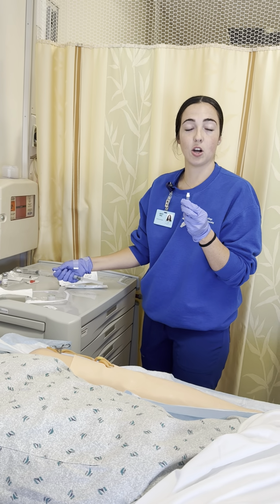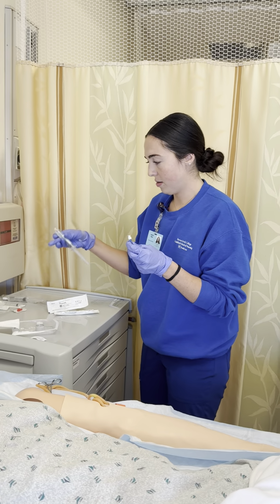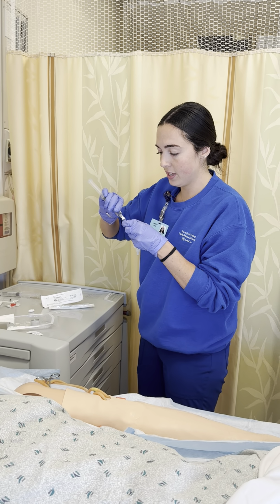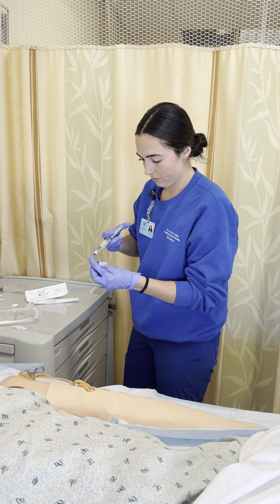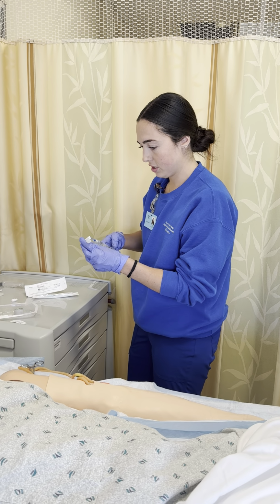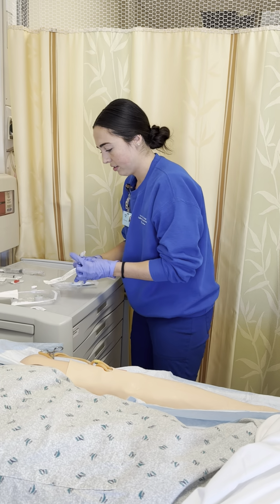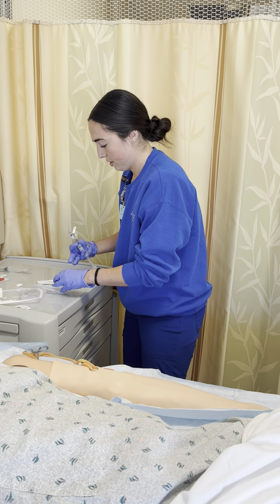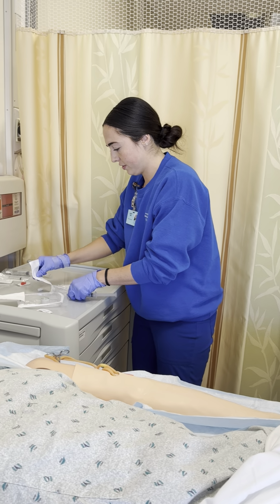Because this was in sterile packaging and I have not touched the hub, we don't have to scrub it. So I'm just going to grab my sterile flush and hook it on there. And we're going to prime it. Looks great. Okay. So I'm going to place this back in its sterile container, making sure it's not touching any other surface.